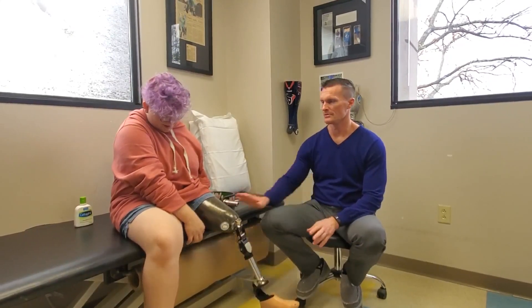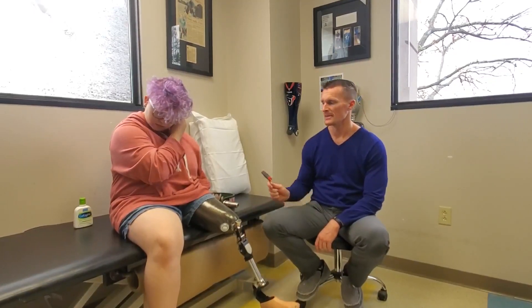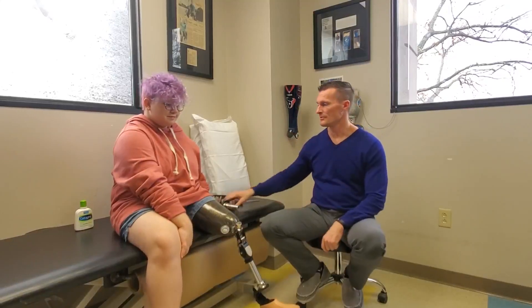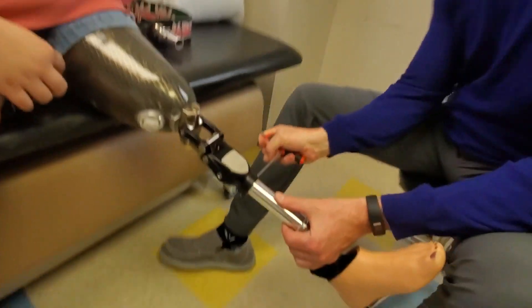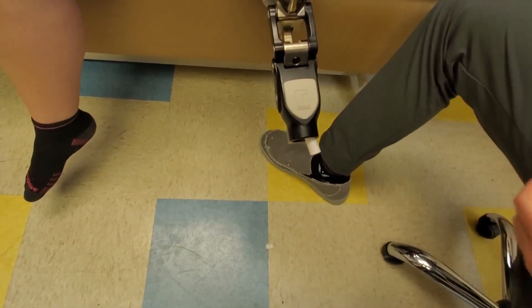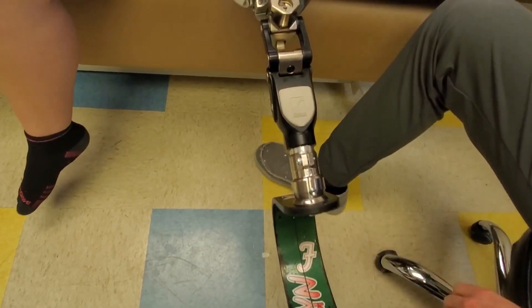It's not a big deal now, plus her limb is significantly stronger to hold the weight with SkinFit. I'm going to show you how she changes this out — it's real easy. We're big fans of not having a whole different leg. We've tried two separate legs with kids in high school and junior high, but it's kind of bulky to carry to school and have a whole leg in your backpack plus your books. This is much easier — just throw it in your book bag and swap it on. She uses a five-millimeter wrench to loosen the set screw on the side, slides this out, and slides the other one in. That's basically all there is to it.